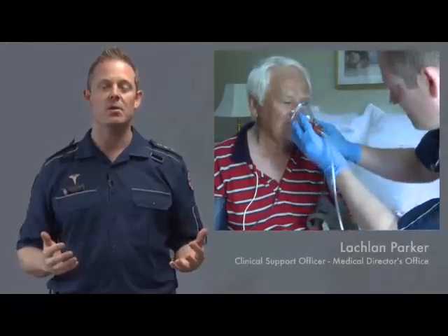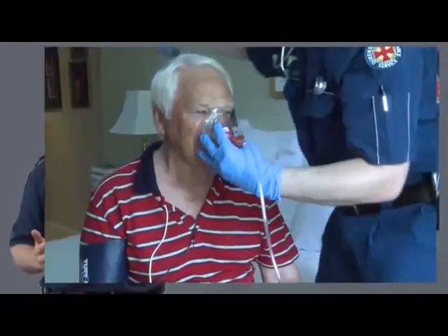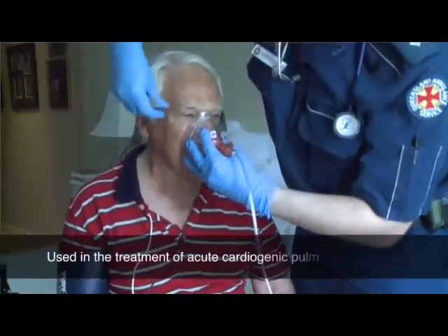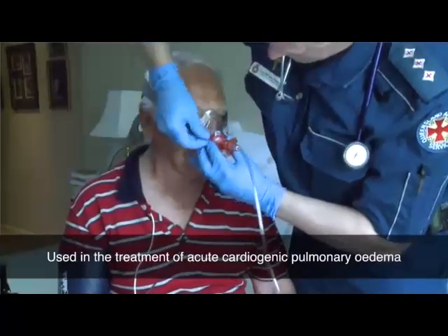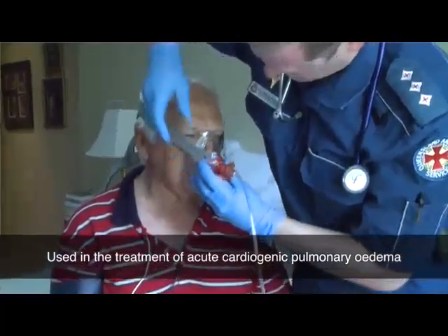Continuous positive airway pressure, or CPAP as it's commonly referred to, is a form of non-invasive ventilation used in the treatment of acute cardiogenic pulmonary edema.